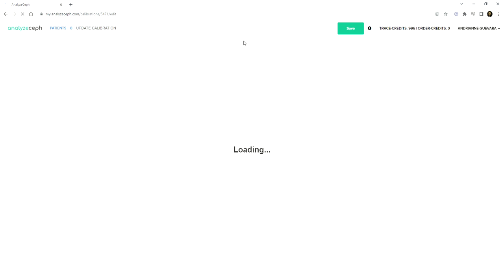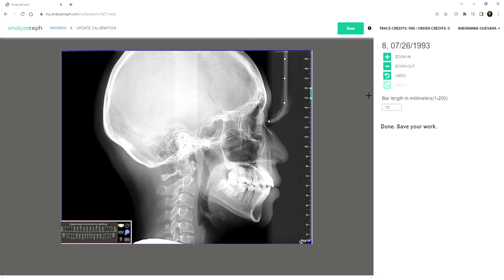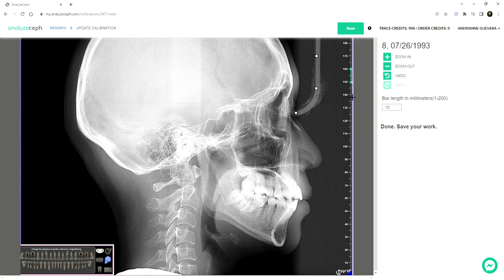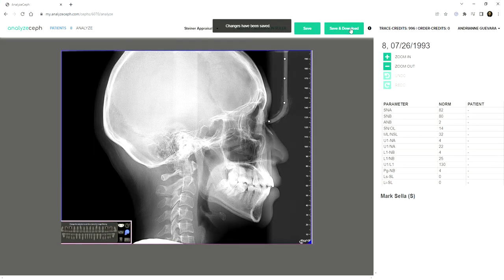It's very important that you always check the calibration. If you already set it, you can just go back and check it again. As you can see here, I already set the start of the calibration ruler here and ended here. I made sure it's 10 millimeters on the side, and on my CEF it's 10 millimeters as well. So we click on Save and going back, we choose the Steiner appraisal.